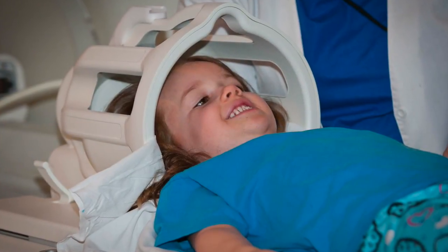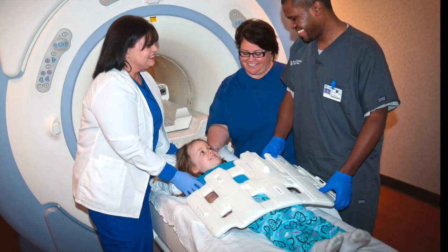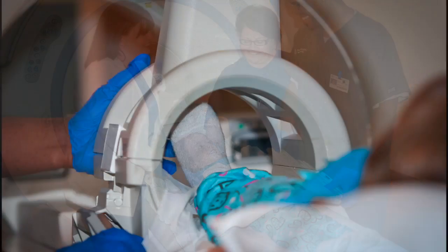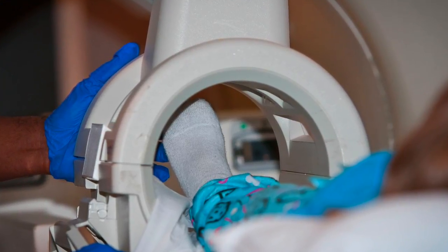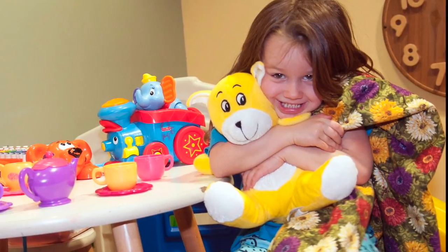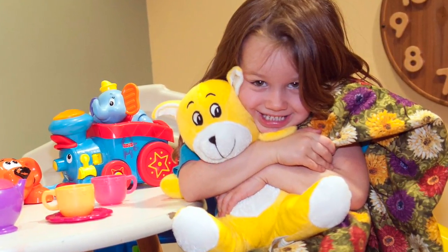If you are getting pictures of your head, you'll get to wear this helmet. This is what it will look like if you are getting a picture of your belly. And this is what it will look like if you are having a picture of your leg or foot. Whichever way you take your pictures, you'll get to take your own blanket and stuffed animal to keep you cozy in there.